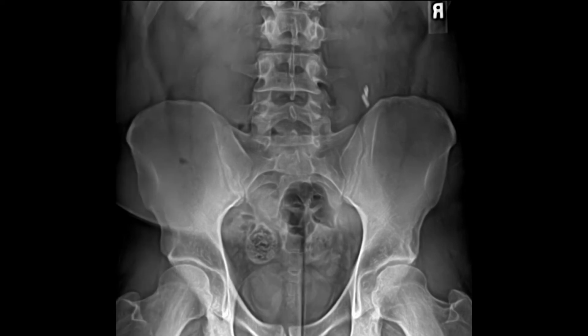In this individual there is a round density on the left side which also contains some air, which is not uncommon. This appearance can mimic a tumor or lesion, but again just represents bowel contents.